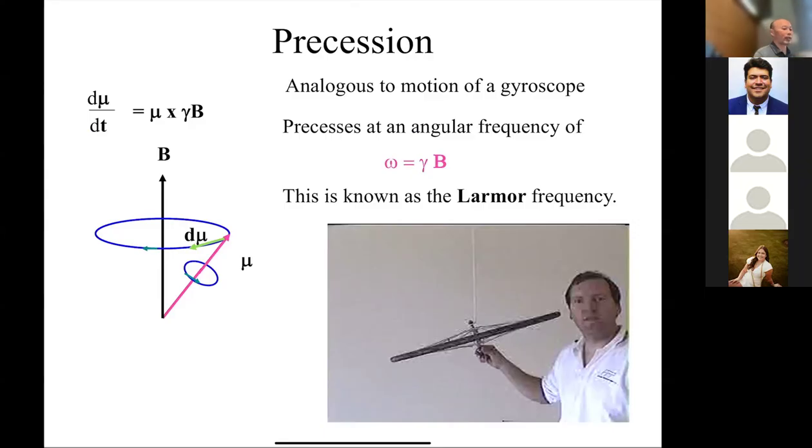So that's all that's saying: not only are your spins somewhat aligned with the Earth's magnetic field right now, but they're precessing around the Earth's magnetic field. And in your homework, you'll figure out what frequency they're precessing at. Right now, even in not an MRI system, you're already in a magnetic field, and so you are exhibiting some of that precession.